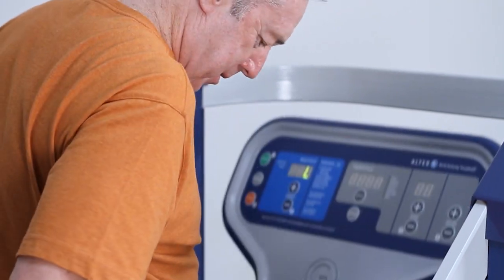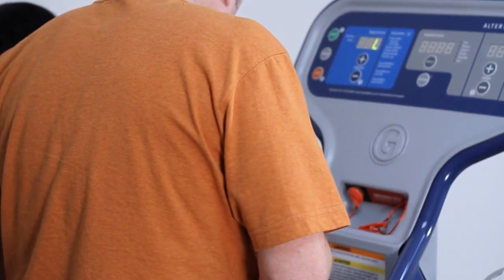Once the patient is in the AlterG, it's important that they have proper trunk support. For patients who have poor trunk control, set the cockpit at a higher level. Make sure to adjust the height appropriately so the patient isn't leaning too far back or too far forward. If you have questions about getting lower-level patients safely in and out of the AlterG, we have a separate video that explains how to do this.